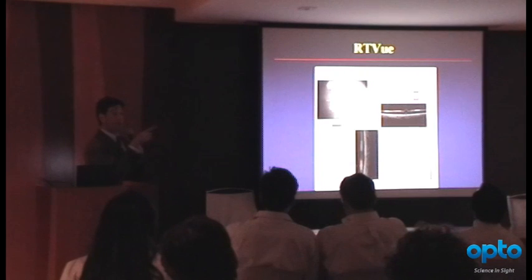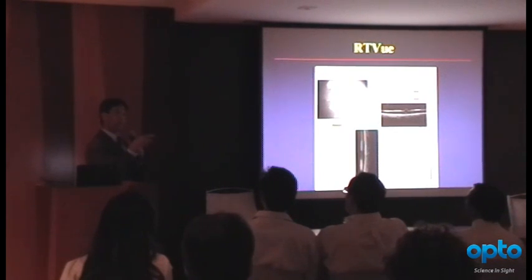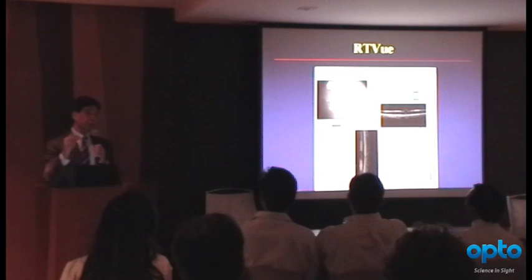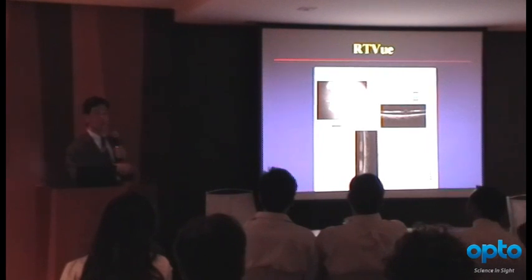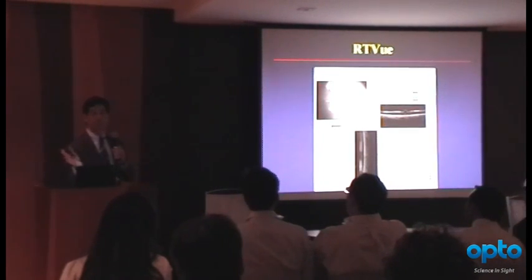This is another example, actually. This is a patient who had macular hole surgery, and this is post-op day 1. And here's the real-time image. You can see the gas bubble, the reflection. It's hard to see the image. We're imaging our patients on post-op day 1 to see if the macular hole is closed. But if the patient can't fixate through the gas bubble, you can't be certain that that center image is exactly through the macula because they're not fixating well.